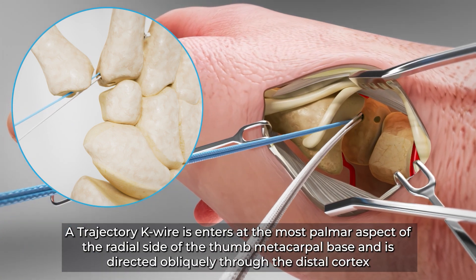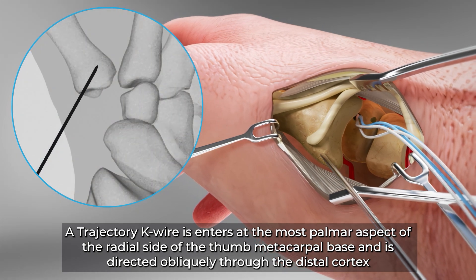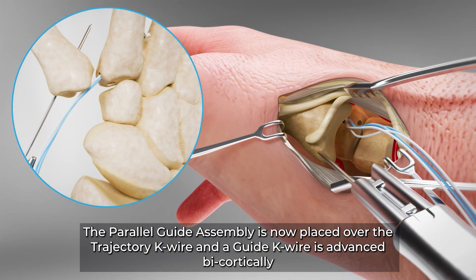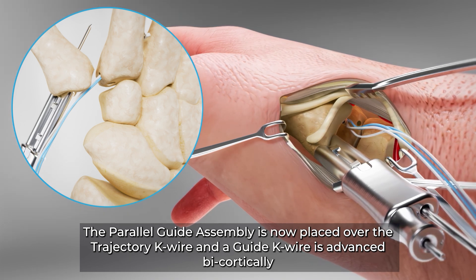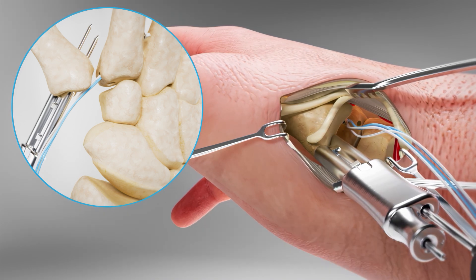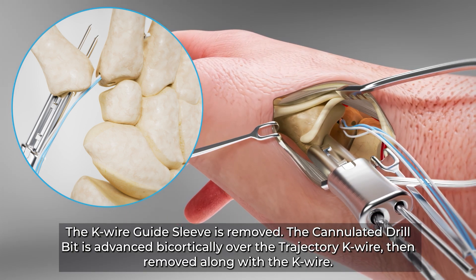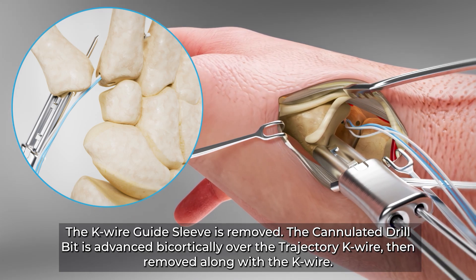A trajectory K wire enters at the most palmar aspect of the radial side of the thumb metacarpal base and is directed obliquely through the distal cortex. The parallel guide assembly is now placed over the trajectory K wire and a guide K wire is advanced bicortically. The K wire guide sleeve is removed. The cannulated drill bit is advanced bicortically over the trajectory K wire, then removed along with the K wire.